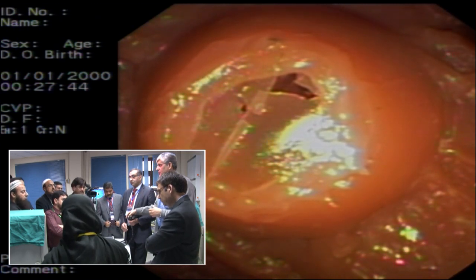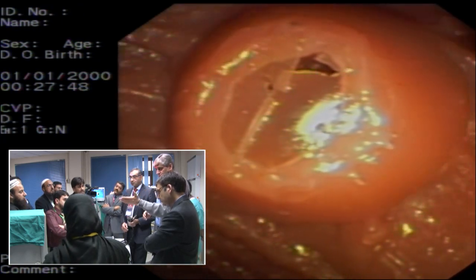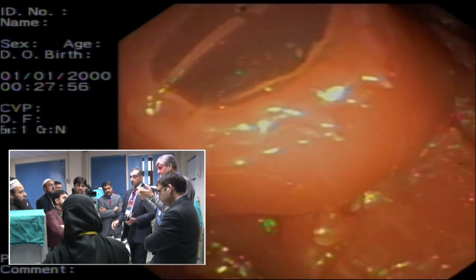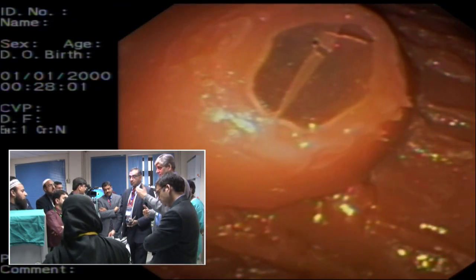But you use the big wheel to put stents, or to bring the ampulla close, to advance the cannula in. We saw there are different techniques. That's what you're saying. This should be in your mind. You should know: if you want to bring the ampulla close, pull back the scope, and it comes back close to you.